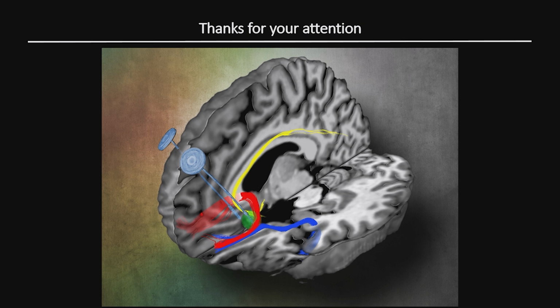I was wondering, very interesting talk, but when you look at the confluence of these three fiber tracks, I would imagine that the overlap can potentially be quite large in some individuals, so there might be multiple potential targets for your DBS electrode. So how, within that overlap region, do you determine a specific point? What other criteria are used? Or is that confluence very spatially confined?